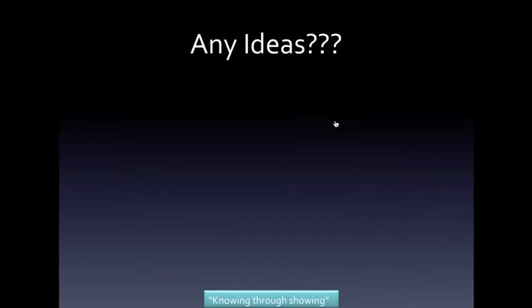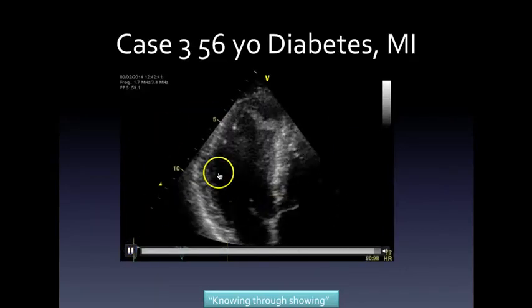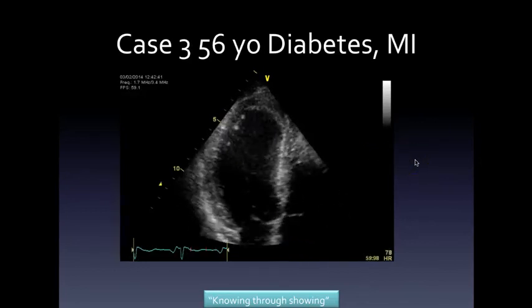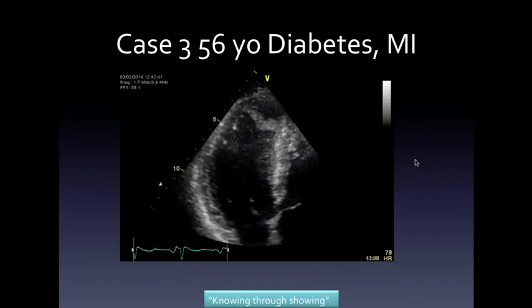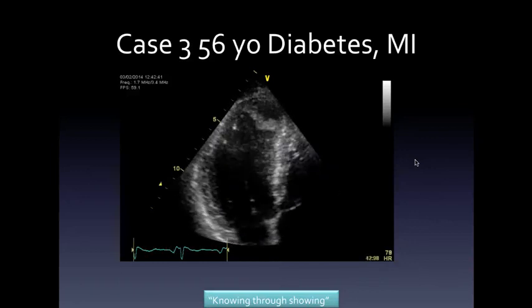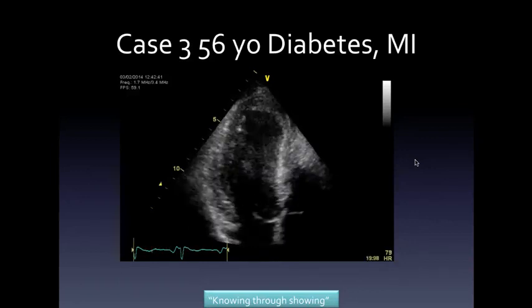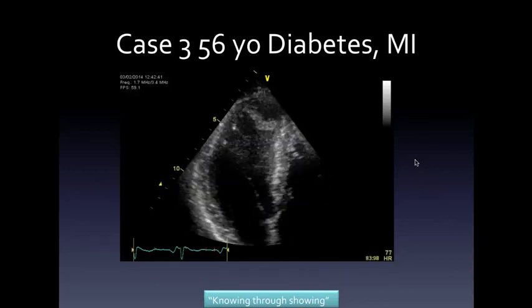So his ejection fraction, look, if you did fractional shortening across here, if you did Simpson's across, you'd actually get not a bad ventricle. But he's got a terrible heart. Do I really care whether you tell me the EF here is 30%? It depends on how you present it. If you want to get a surgeon and say, oh, EF is 35, go for it. But really, what does the ejection fraction tell you here? Bad heart, something serious. So what might you do? Like the New England Journal case report, what next would you do? What test would you do? A diagnostic test was performed.